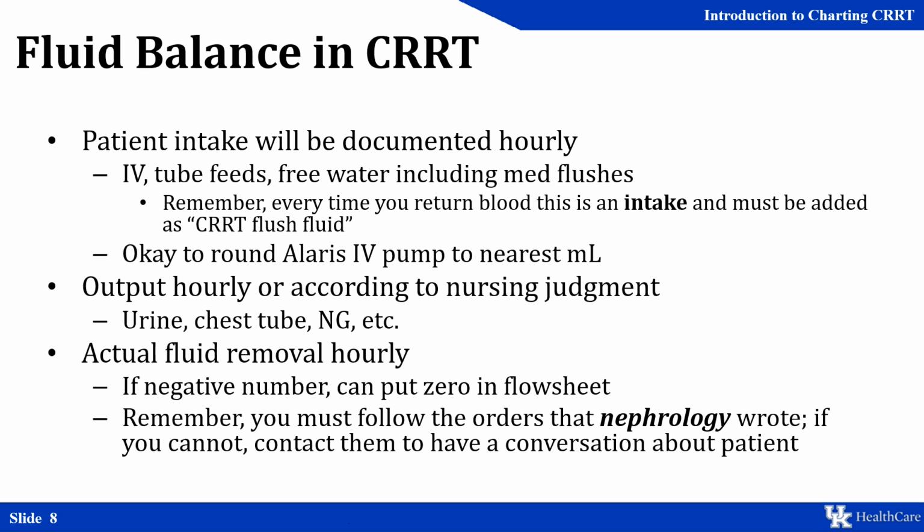After all, they are the experts and have more than enough information to know on that patient whether they need to be net even or net negative. It's fairly rare that a patient should have a true 0 patient fluid removal because that means that every hour they'll get positive. Most patients, by the time that they're on CRRT, have been more than adequately fluid resuscitated, so it should be fairly rare.